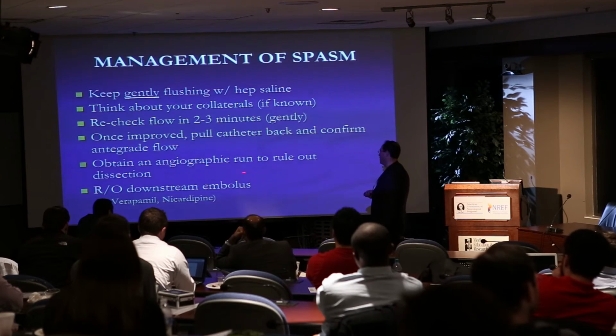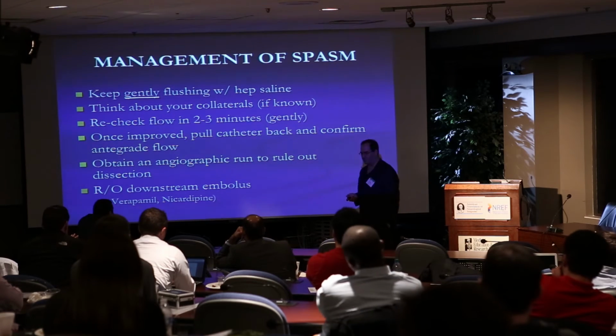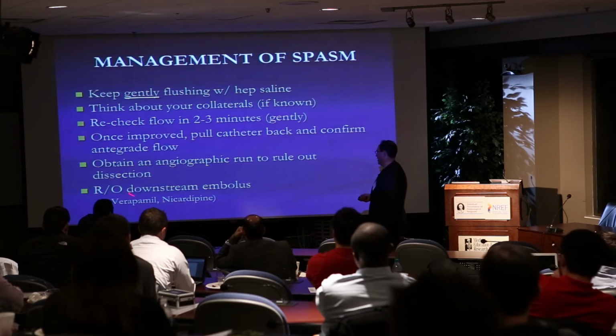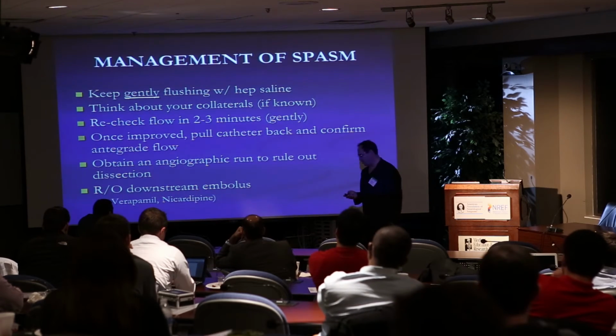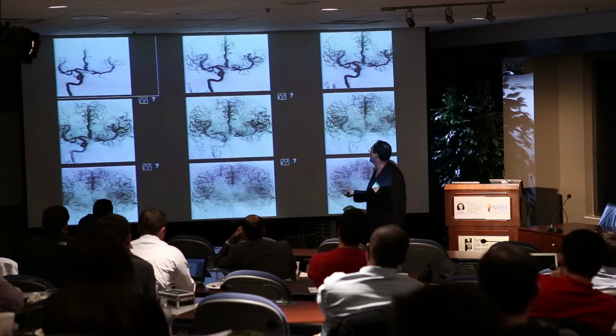And then just do a run to make sure that you didn't do some damage to the vessel. And obviously you want a whole run over the head to make sure that you didn't send something downstream.